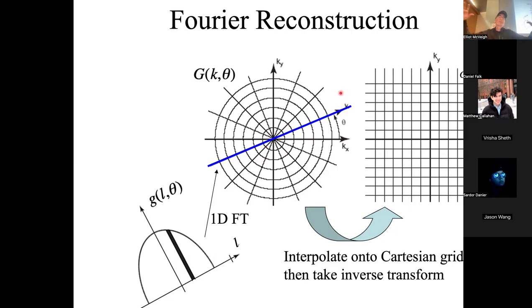So it gets harder as you go farther and farther out, right? That's one issue. As we go towards the origin, we get a much denser sampling. So we have much better estimates as we go to the origin, right? But we have to correct for the fact that there's more signal power at the origin, and we'll see that in a second.